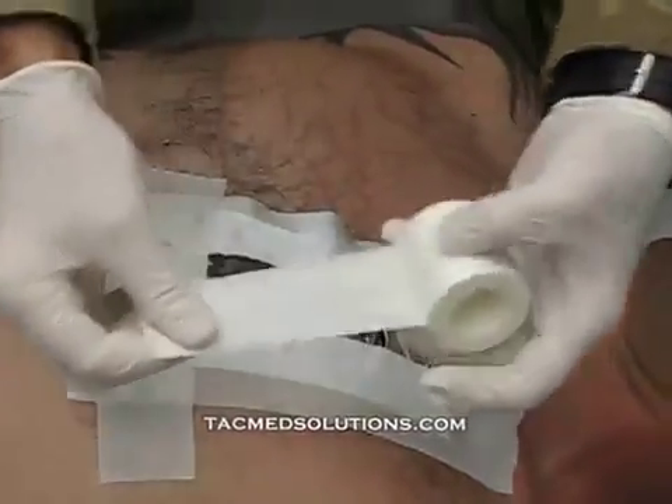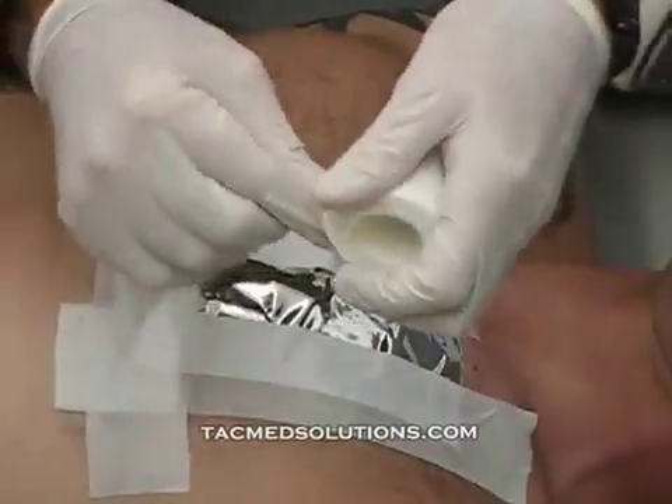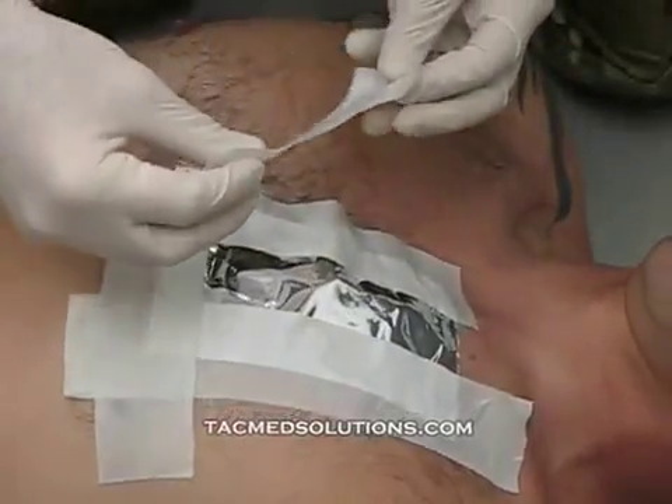If a four-sided occlusive is to be applied, the last piece of tape should not be applied until the casualty exhales.